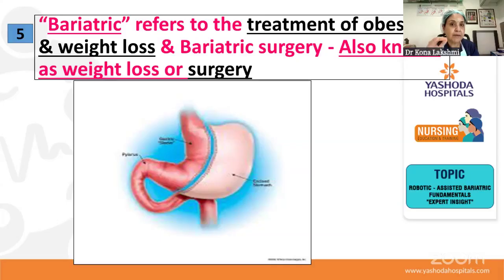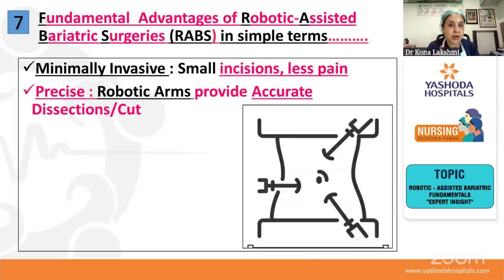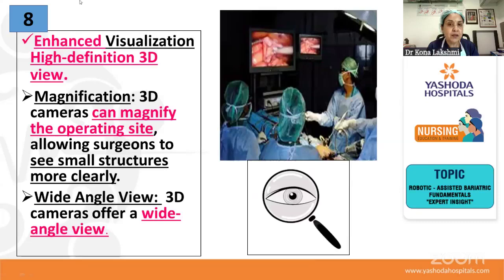Okay, and then magnification. You get magnification. That is also depending upon the organ you are seeing. If you see the liver, a big organ, 1.5 kgs, if you see it 10 times magnified, it is like you are seeing a mountain. There the AI will curtail it. How much you should get is a real time image. A small micro blood vessel, you will see it big. So that is the difference.